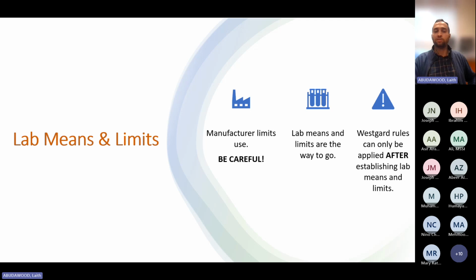So you just take your data and put it on this My Expert QC platform. My Expert QC will give you the answer. It will tell you your Compact Max is reading 13 seconds. All the other labs are reading 13 seconds. You tell the customer, see, you are saying the target should be 14, but all the other labs are reading 13 seconds. So your analyzer is fine. You don't need to complain. Stop complaining. So using the manufacturer limits can be a tricky business.